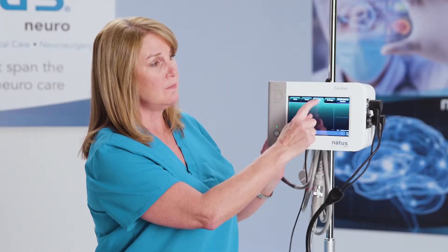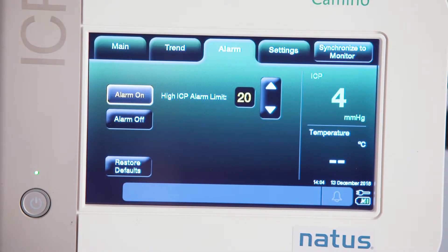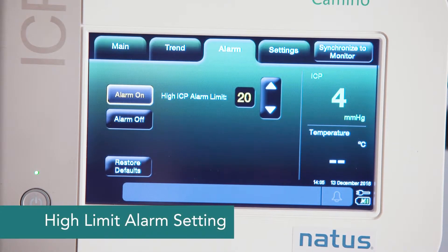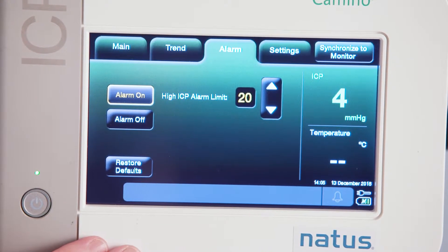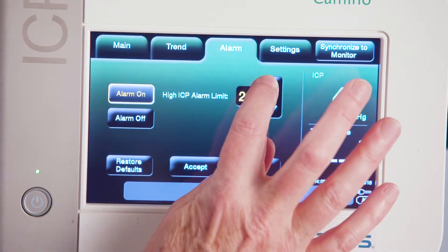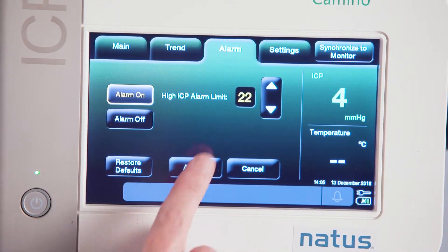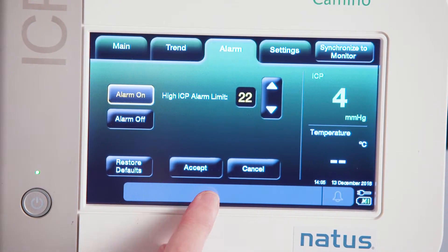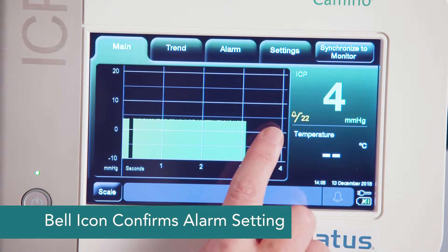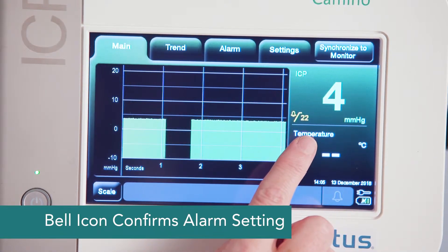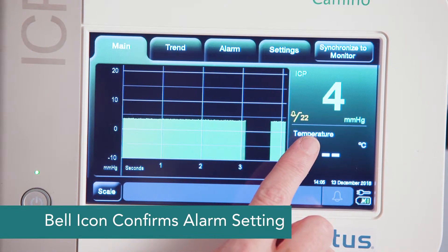The next tab over is alarm. In the alarm screen, we're actually able to change what our alarm value is — it's our high limit alert alarm. Right now our alarm is set at 20. If I want to change that to 22, I'll hit the arrow up button to 22 and then I just need to accept that value. It takes me back to the main screen and I have a bell here telling me my alarm is on and it's set at 22.